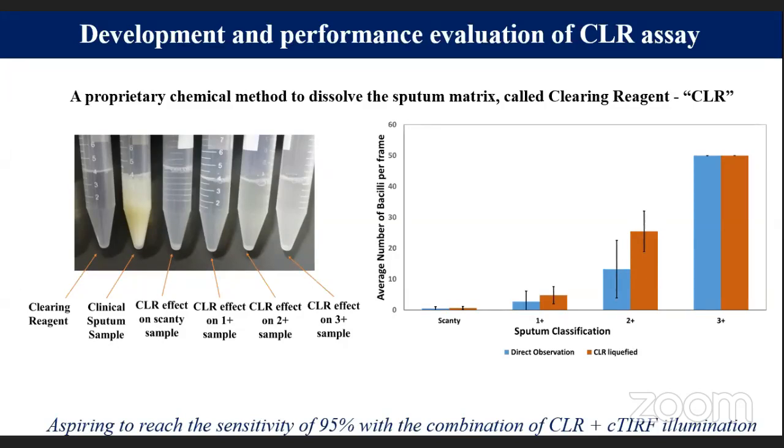fields of view. So you can see that no matter how the sputum is, it gets very easily homogenized and almost transparent. So the reproducibility of the test keeps on increasing. This is the enhancement when we directly used it with SeeTB, or after that, when we used it with the CLR liquefaction.